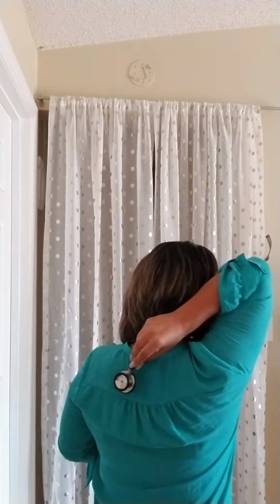So if you've noticed, you've probably been to the doctors before, and they place it directly on your chest where it's cold. The good doctors and nurses, they remember to warm it up for you before they put it on. But this tool is actually used to listen to heart sounds. It listens for any irregularities. It's also used to listen to any of your lung sounds. They'll listen down here as well. And they'll also listen here on the back of your lungs.